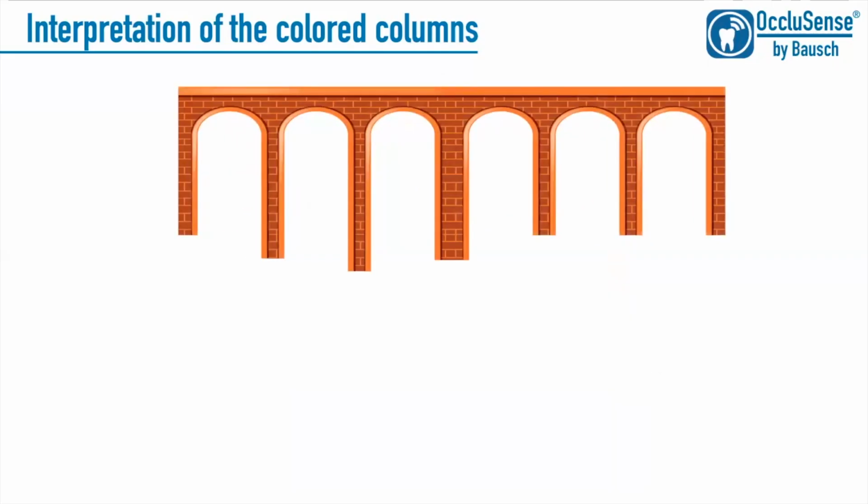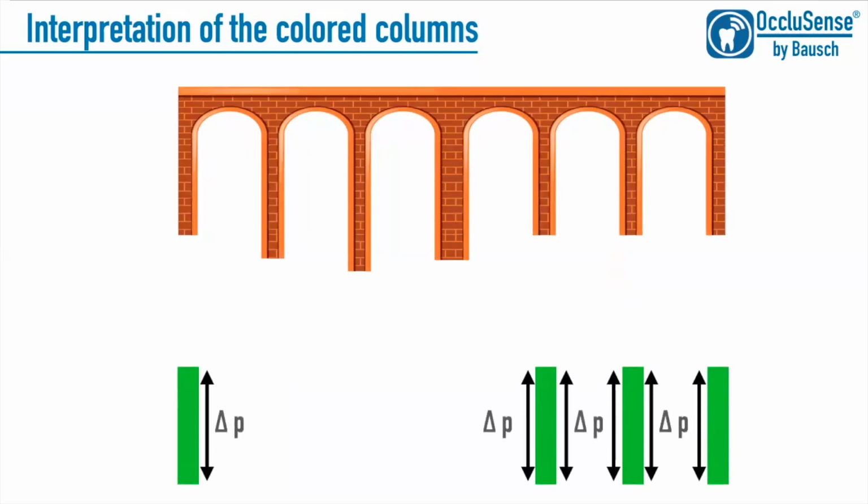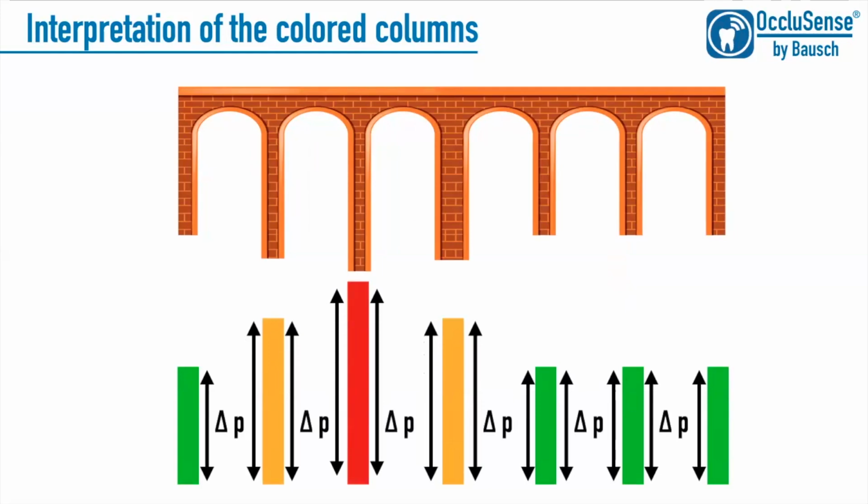Here is another unrealistic bridge to try and visualize this a little bit more. You can see that the smaller pressure areas have been changed in column height, and the punctual contact surface is red.